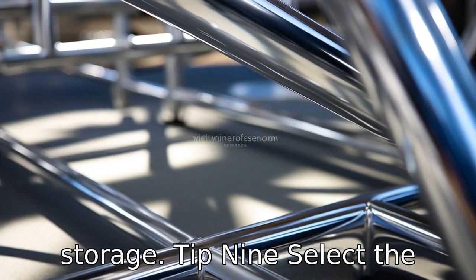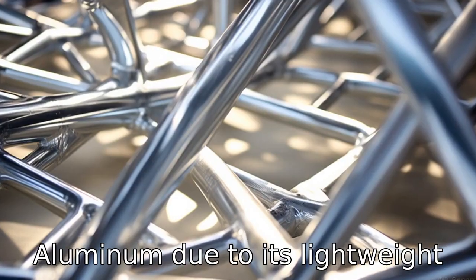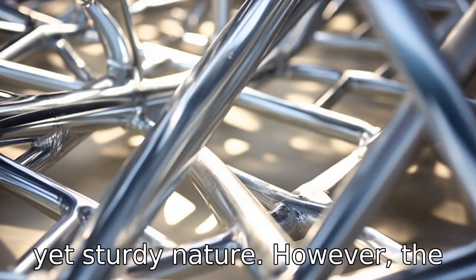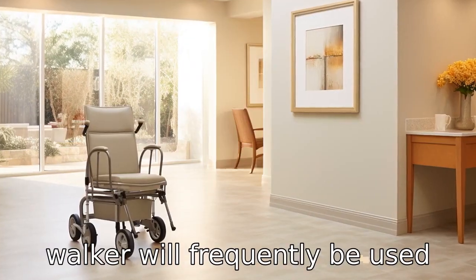Tip 9. Select the correct material for the frame. Most walkers are made from aluminum due to its lightweight yet sturdy nature. However, the frame should also be rust resistant, especially if the walker will frequently be used outside.